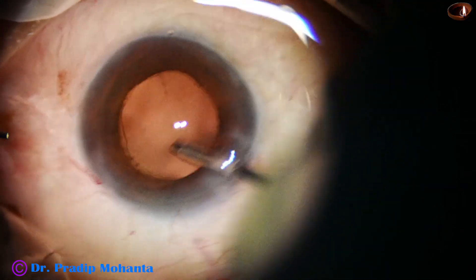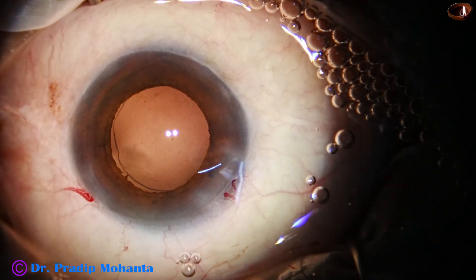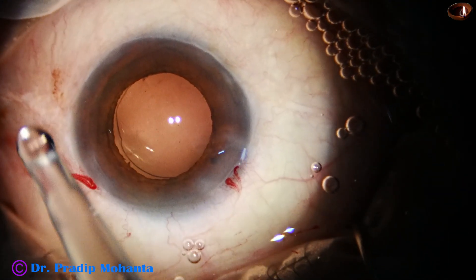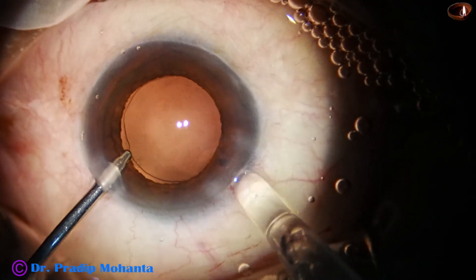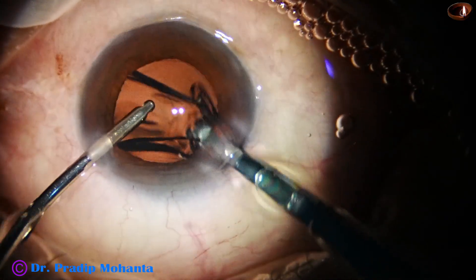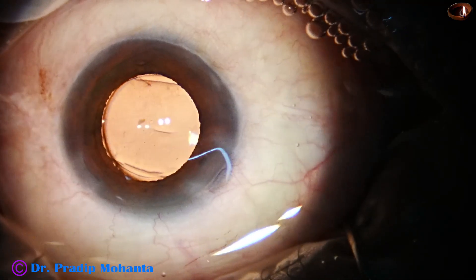And this is hydro polish using the irrigating jet of fluid only, to polish the posterior capsule. And finally, this is hydro implantation of a single-piece monofocal intraocular lens, and the lens goes into the capsular bag.